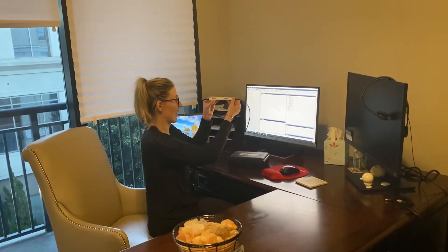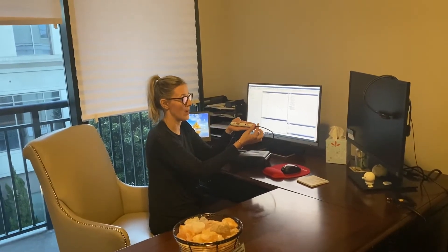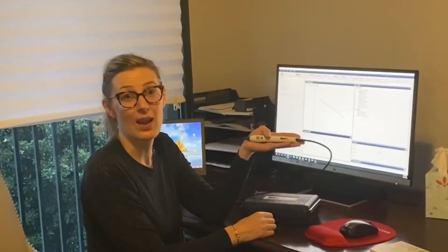Hi everyone, this is Julia with E3 Teleacoustics and today I'd like to take a moment and show you the new Medrex video otoscope. We have it right here — very small, lightweight, and it's about the size of my hand. It's got a phenomenal high-definition picture quality to it as well.